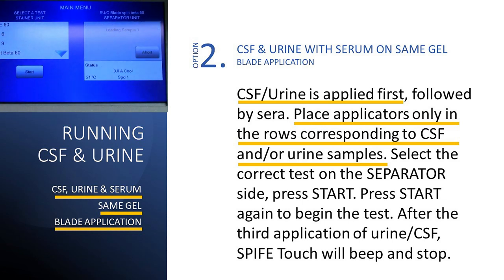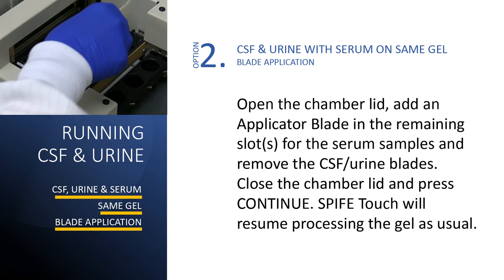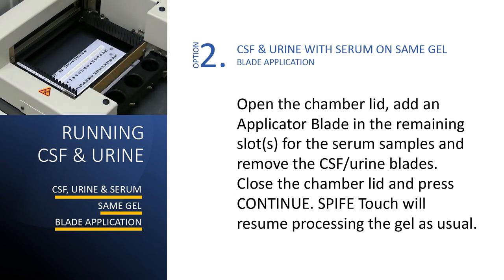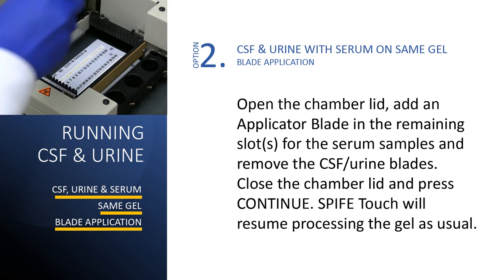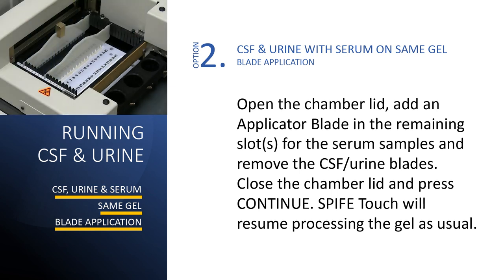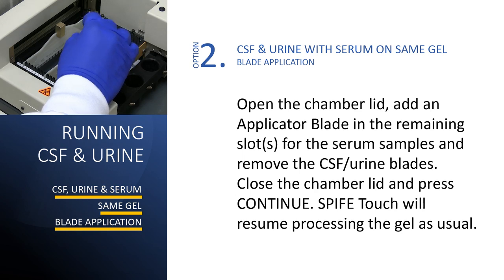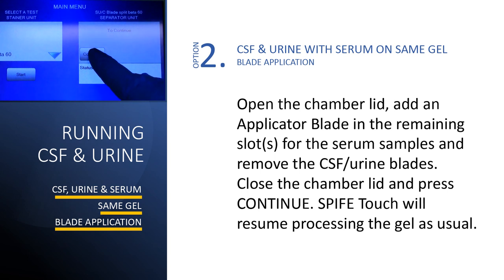After the third CSF and/or urine application, the instrument will beep and stop. Open the chamber lid, add an applicator blade in the remaining slots for the serum samples, and remove the CSF and/or urine blades. Close the chamber lid and press continue. The instrument will apply the serum samples and the SPIFE Touch will continue processing the gel as usual.